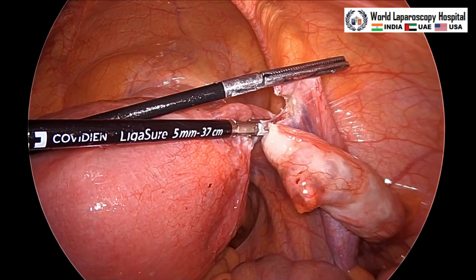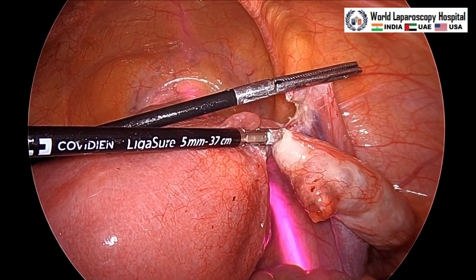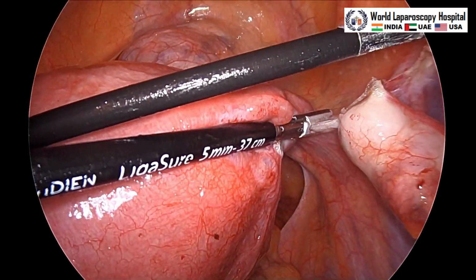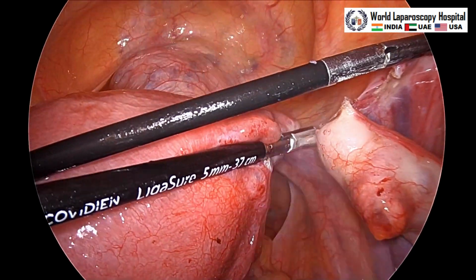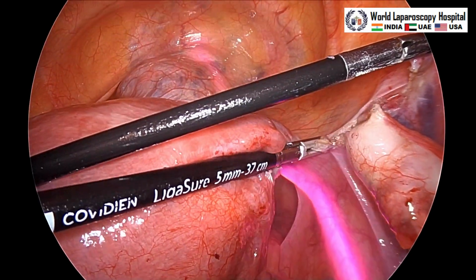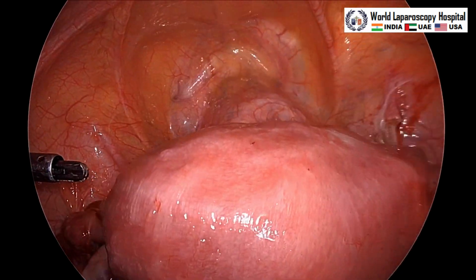Now this is the mesosalpinx and meso-ovarian, and the ureter is down, much down as you can see, and then we will go 2.5 centimeter over the broad ligament. So now after this we will not go further. You should only go further after opening the anterior and posterior leaf.